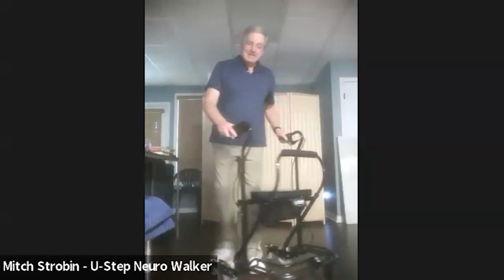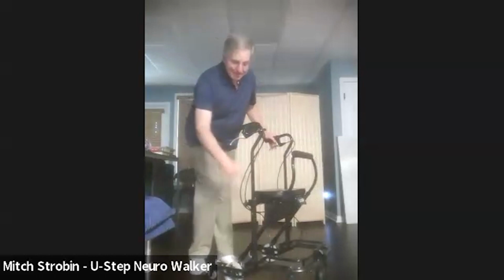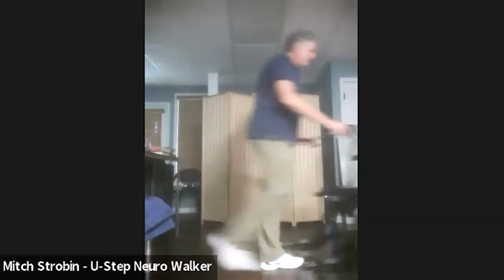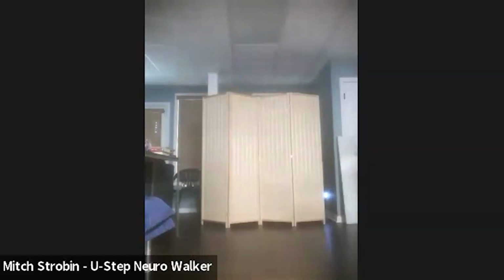And what's nice is that it's the same base. Nothing has changed, just different handlebars to address possibly other conditions, okay? So this is the standard. I'm gonna move it out of the way, but I'm not leaving. I promise I come back. Hopefully no one was worried about that, but I am coming back.